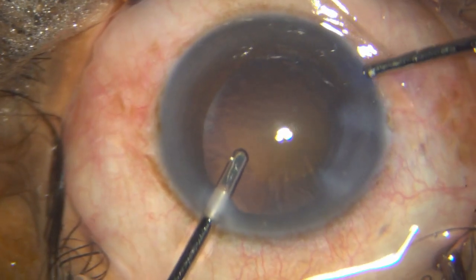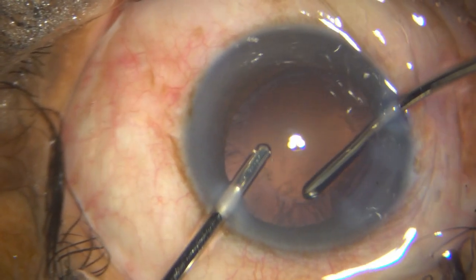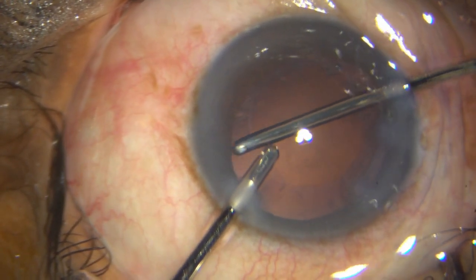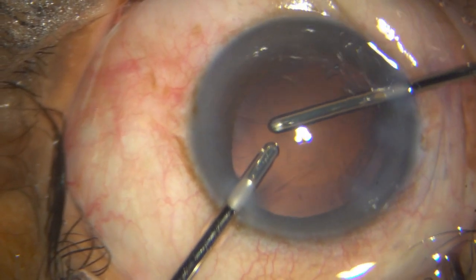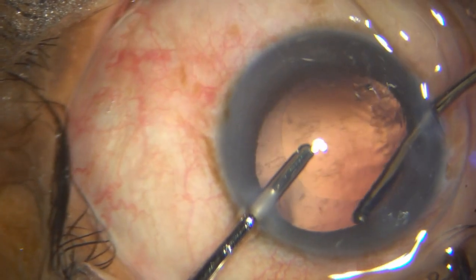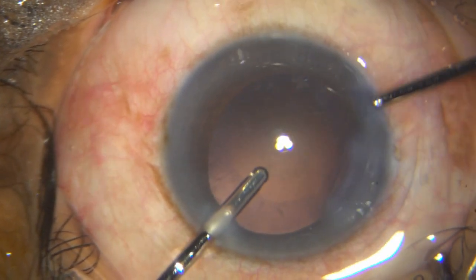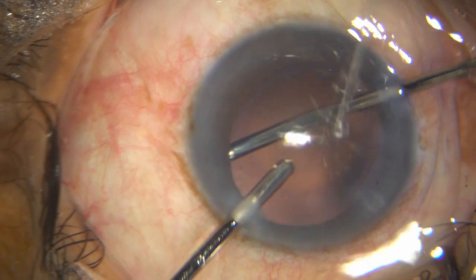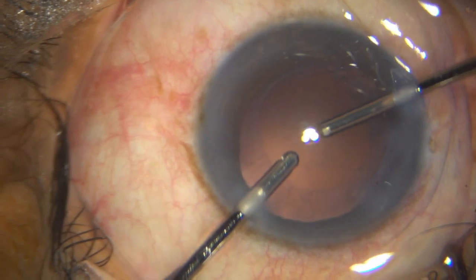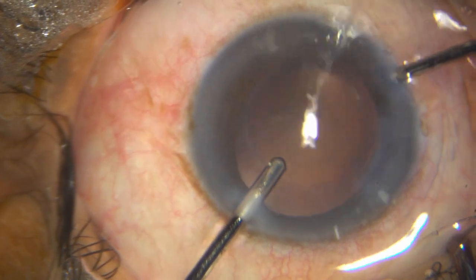Now once that hard part is done, there are only a few cortical fibers, so you have to be a little bit careful here when you're aspirating, because this capsule may not be very stable, this bag may not be very stable. Moreover, both the anterior and posterior capsule can be quite close to each other, so there is a danger of engaging the posterior capsule as well, other than zonular dialysis. Look at the posterior capsule, how it is flailing around, and there are some fibers sticking onto it.